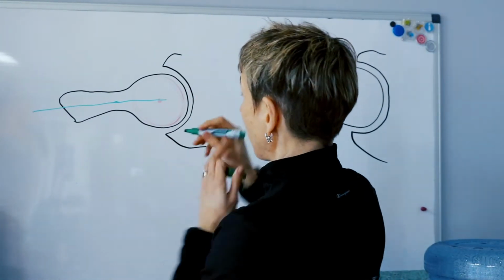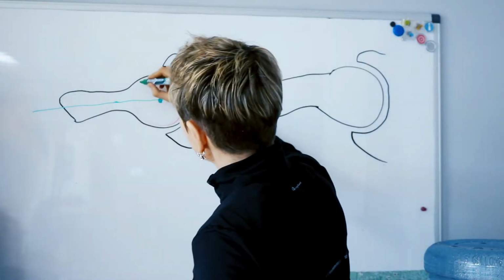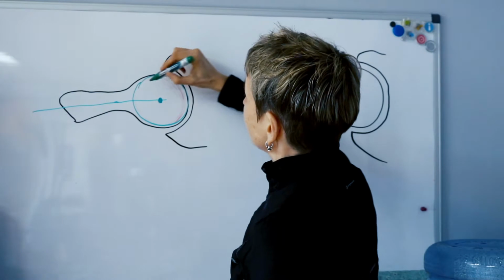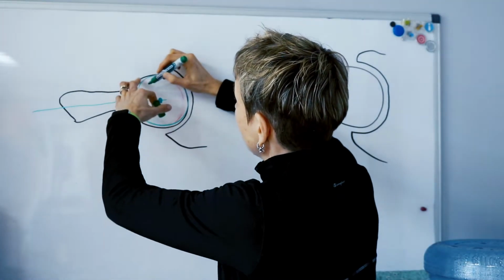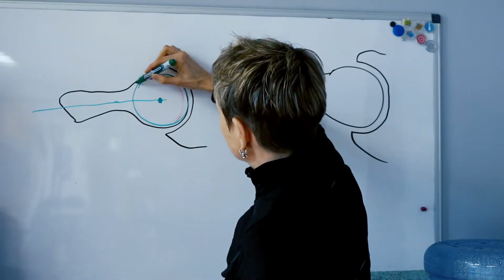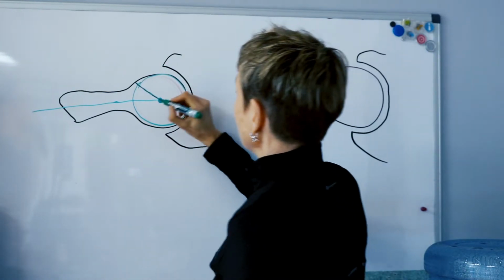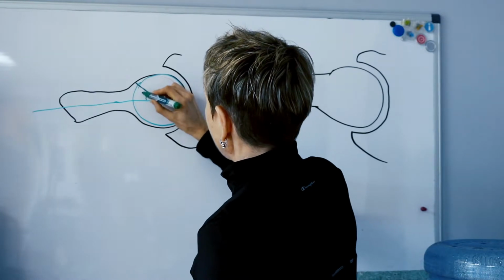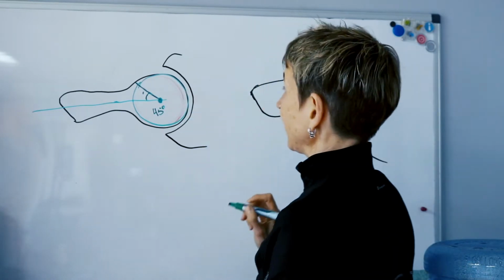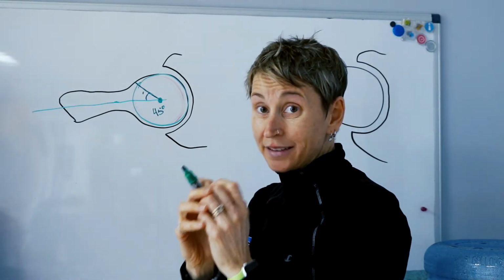So what's the other axis of the angle? Well, again, starting from the middle of the femoral head and that circular shape, it's the point where the femoral head deviates from this circle. So let's say in this one it's there. This would be the alpha angle. So in this case it would be like a 45-degree alpha angle, where this kind of deviates from the circle of the femoral head.